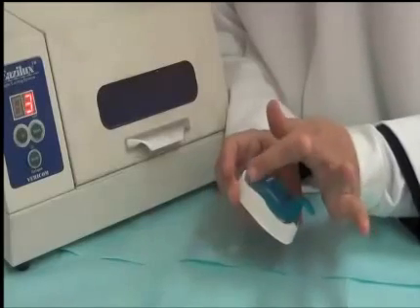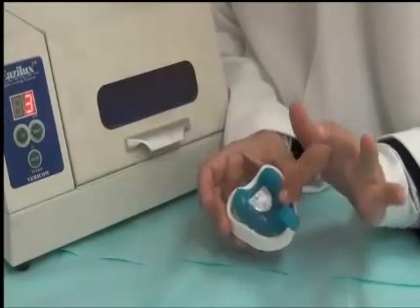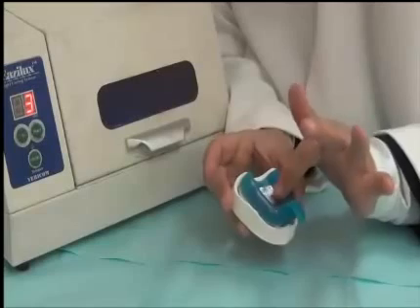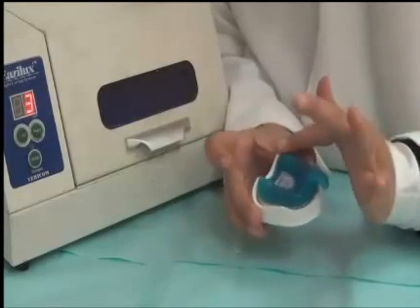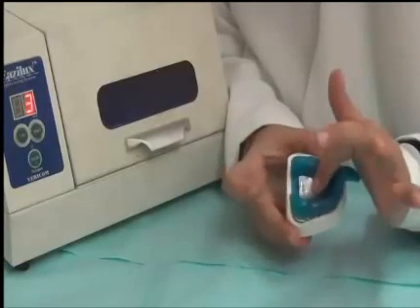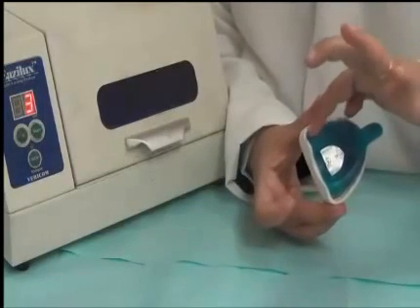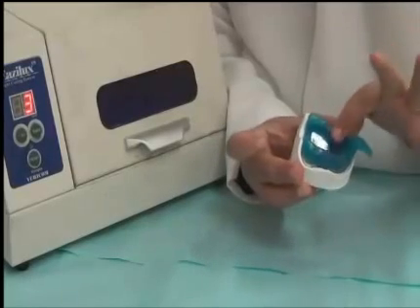So using Vaseline, it will smoothen the surface. It will aid in the adaptation of the handle to the body of the tray. And it will reduce or prevent the air-inhibited layer. So once the material sets, we will not have the tacky part on the surface. And we have here the opaque layer. This will reduce the shrinkage in the palatal area. And it is fully adapted from all sides.